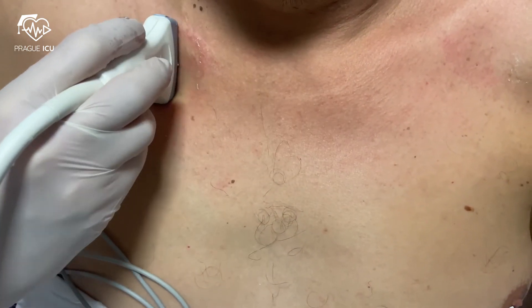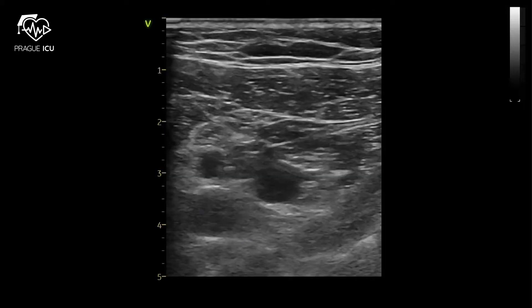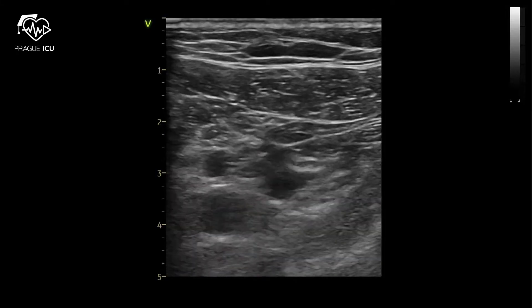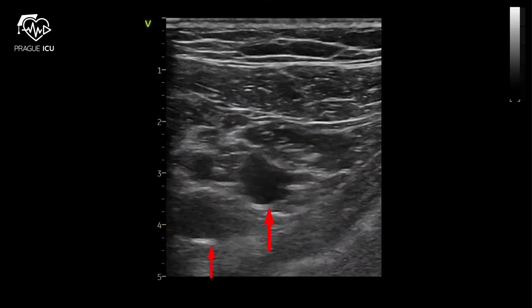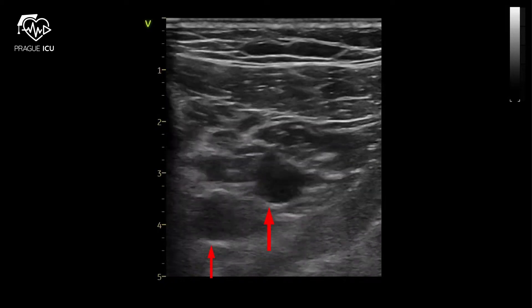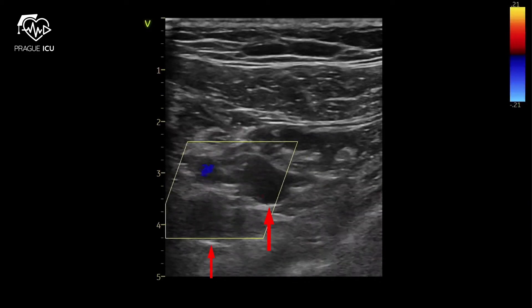Before the procedure, perform a provisional ultrasound to check vein patency and exclude thrombosis. Also check the diameter of the subclavian vein. First, use the transversal view to visualize subclavian vessels.